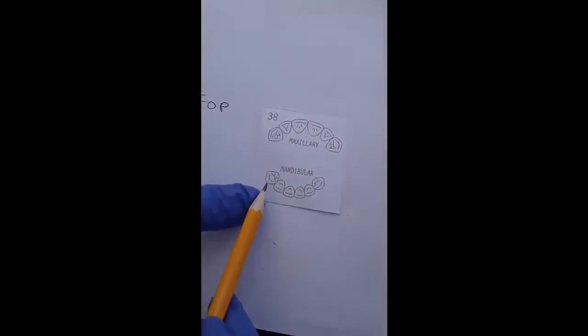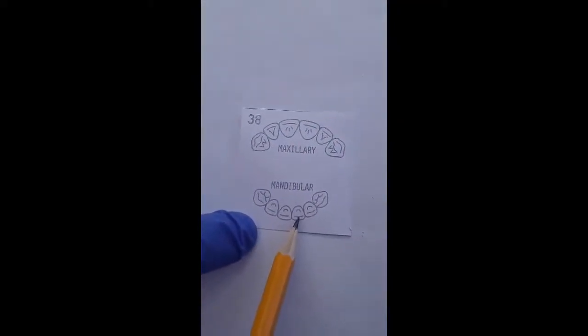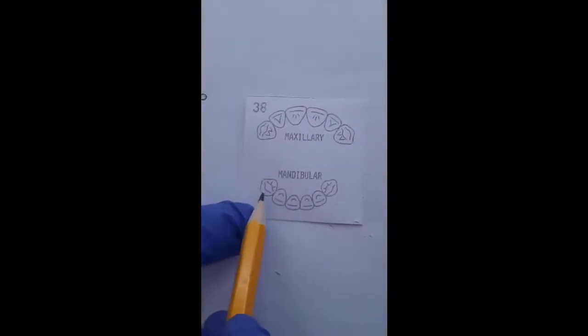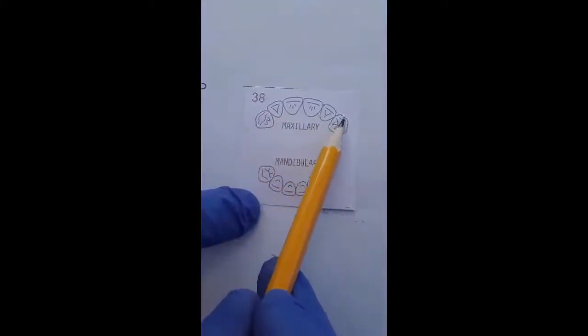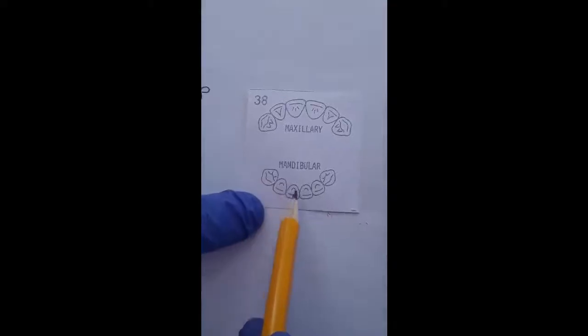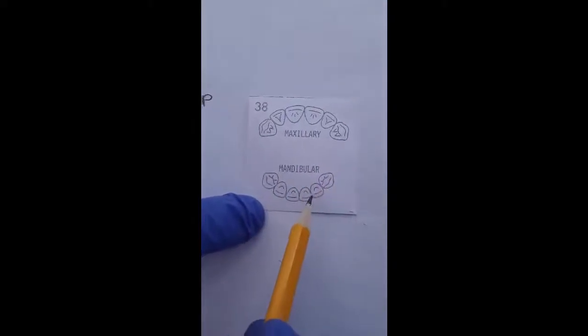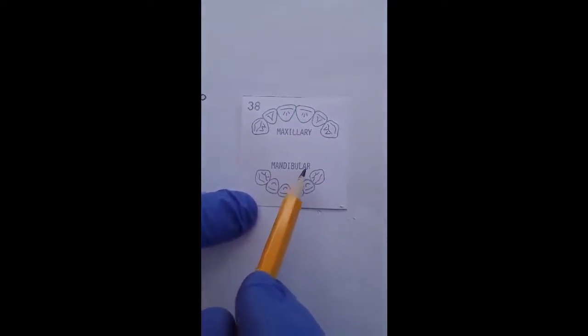Now if we look at the occlusal view, we can see the shape of the arch, each tooth will re-establish the labial contour of the wax rims, and the shape of the arch will be similar to the shape of the maxillary arch. So they are the same curvature, as if they are parts of two circles with a different diameter.